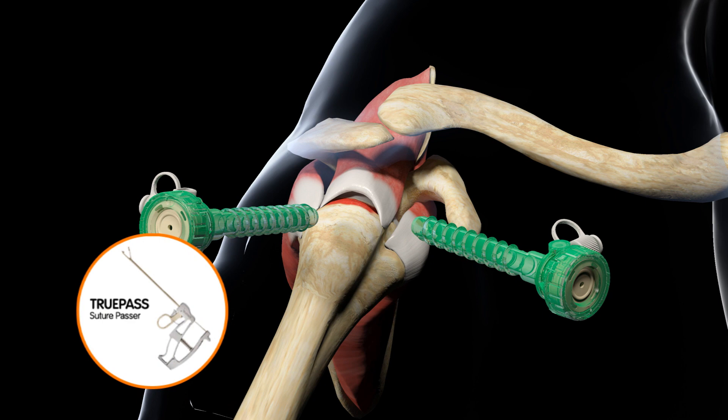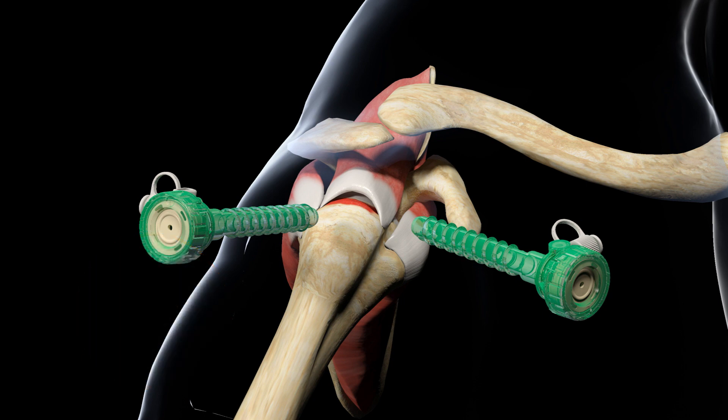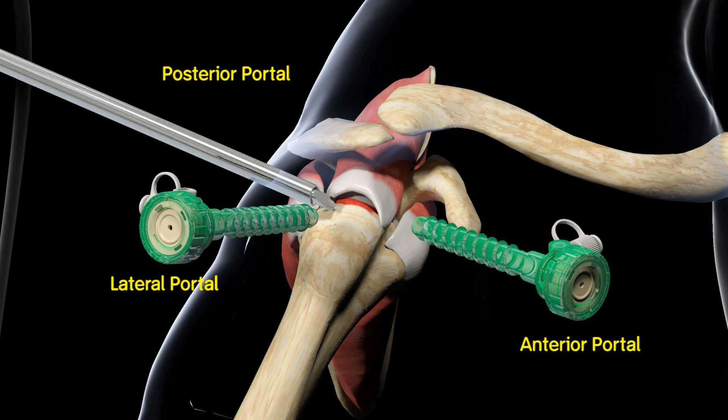The TruePass self-capture suture passer simultaneously passes and retrieves suture and Ultra Tape. This technique is achieved using the following portals: anterior, lateral, and posterior. Visualization during the repair is accomplished through the posterior viewing portal, while a superior lateral portal is used for placing the medial anchors.